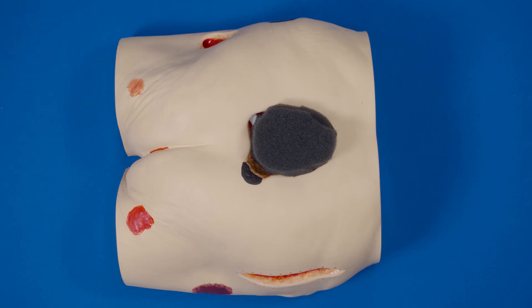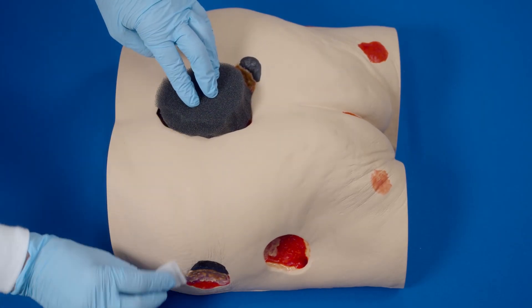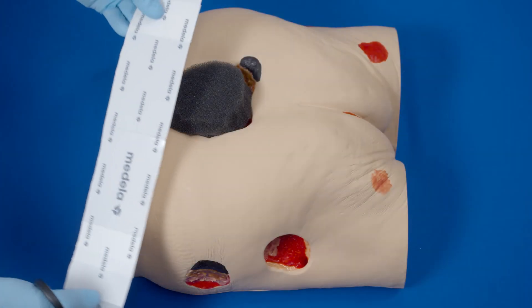Do not allow the foam to overlap onto intact skin. If utilizing white foam, ensure the white foam is in contact with the black foam — foam touches foam. Always select an area to relocate the fit pad.